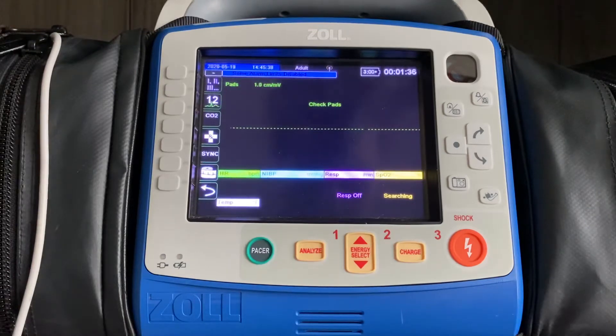Whether your X-Series has just SpO2, carbon monoxide, or methemoglobin, the ability to make sure that you're getting good, accurate readings lies in understanding the other value that you see on the screen, which is the perfusion index.